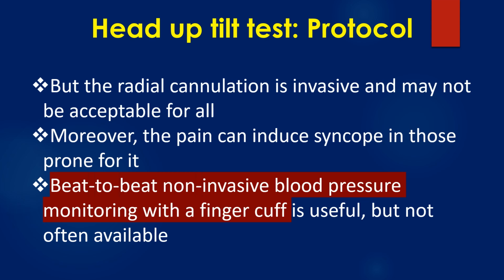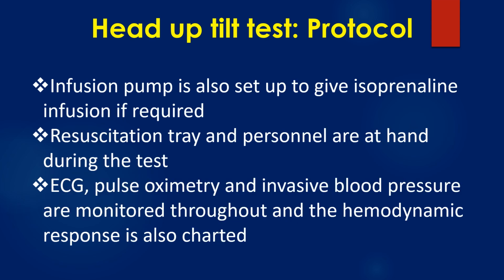Beat-to-beat non-invasive blood pressure monitoring with finger cuff is useful but often not available. Infusion pump is also set up to give isoprenaline infusion if required. Resuscitation tray and personnel are at hand during the test. ECG, pulse oximetry and invasive blood pressure are monitored throughout, and the hemodynamic response is also charted.